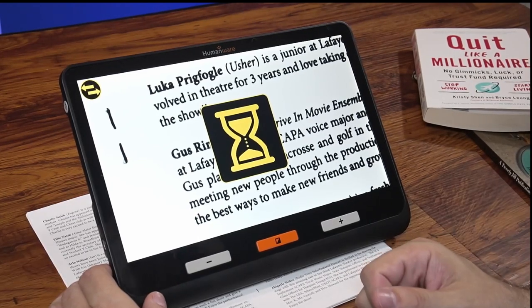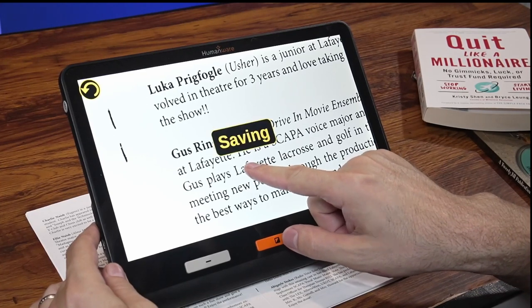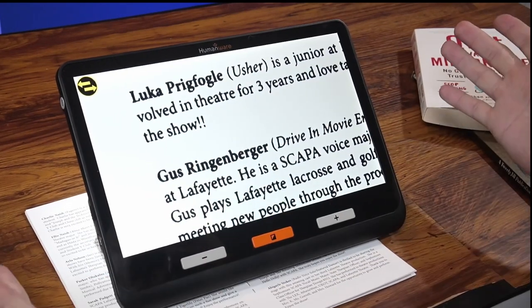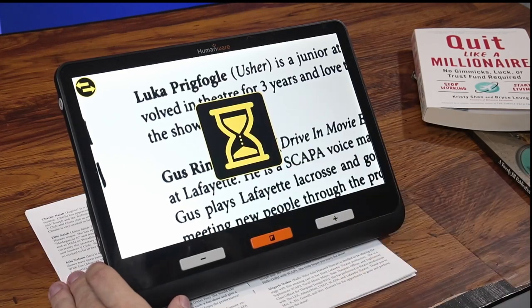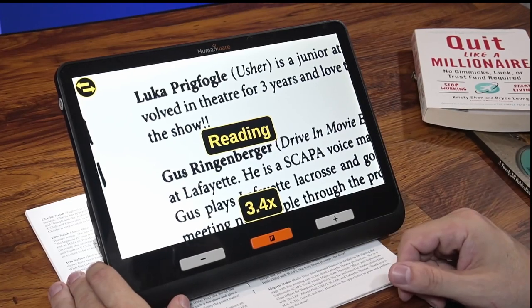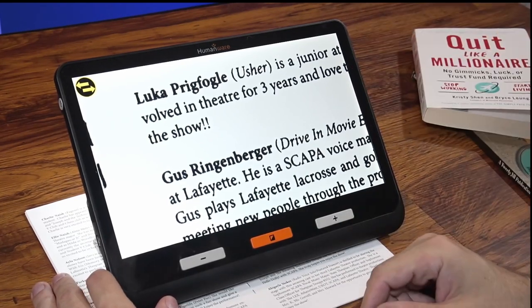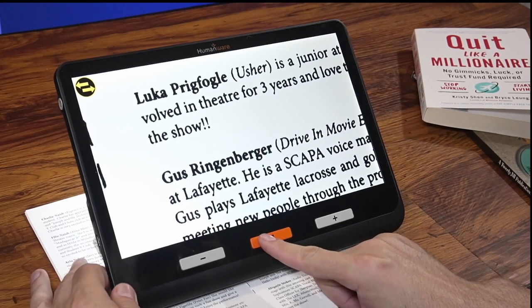You also have the option to save an image. Long pressing on the screen saves a screenshot and displays a saved message. You can do this in live view too — tap and hold, and it saves the screenshot with a vibration confirmation. Saved images can then be accessed through the gallery, which is located in the settings menu.